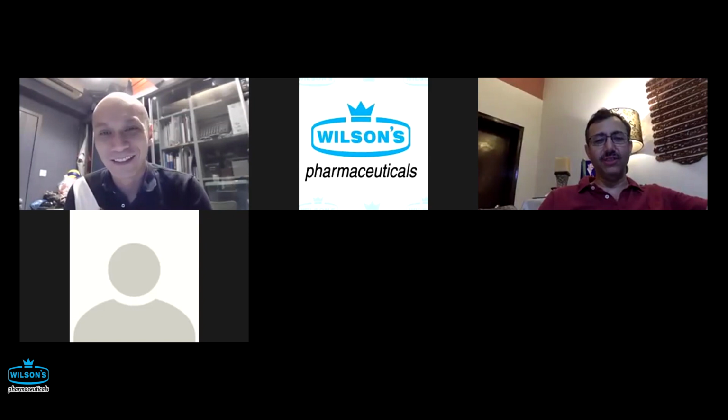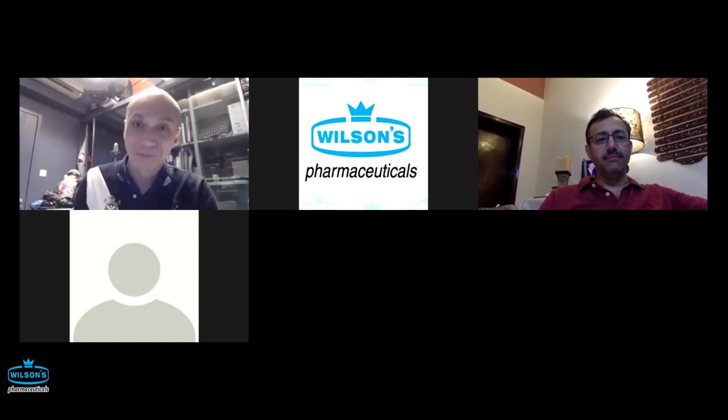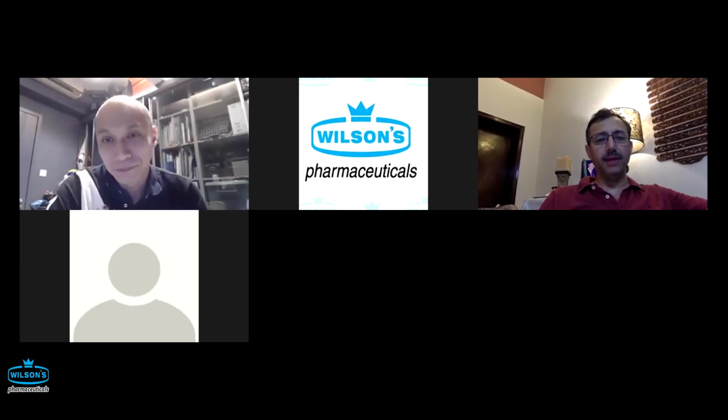Stones with lots of facets and a size bigger than 15 or 18 millimeters may be the ones that are difficult to take out. But otherwise, most stones, even with a bigger size, especially oblong type, as long as their transverse diameter is good enough to be taken out through the cut papilla, I think we need to stay with the conventional measures.